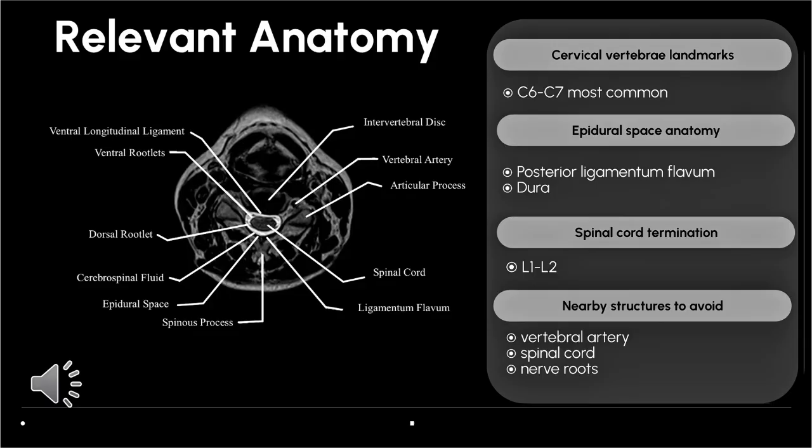The cervical epidural space is shallow. Above C6-7, the margin between the ligamentum flavum, dura, and spinal cord is razor thin. Remember, the spinal cord typically ends at L1-2, but in the cervical region, it's right there. Vertebral arteries course laterally, so avoid lateral drift. Paramedian entry can reduce risk of ligament gaps, but the midline approach may be better for fluoroscopic clarity.